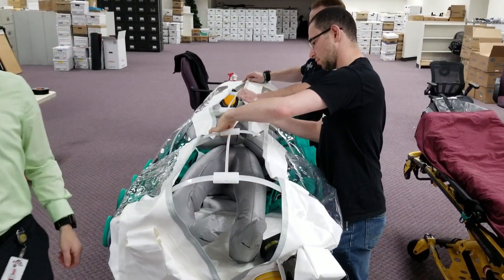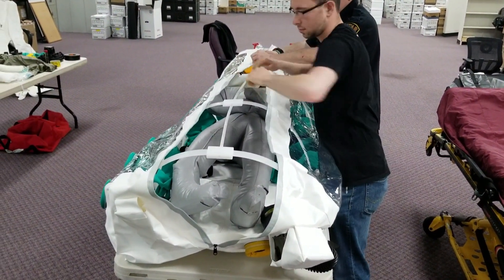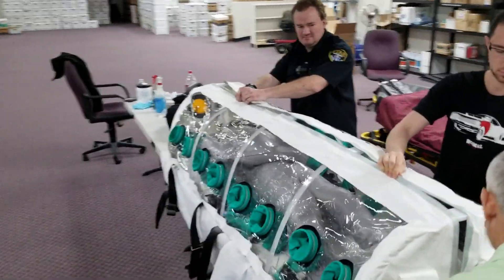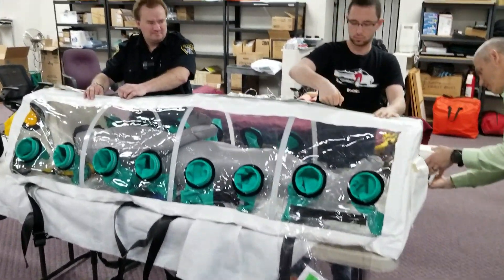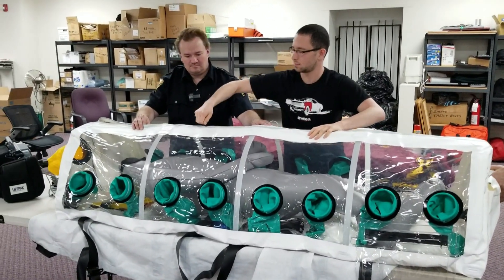The idea is that the patient will be placed inside of it, and any invasive procedures that would normally be done on a patient like this we would not perform, because of the jeopardy that places on the integrity of the isopod itself.